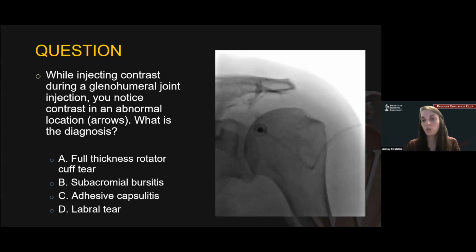Yep. So when we are having our patient in their position with their arm by their side and supinated, then I'll typically have my II just a straight AP to the patient. So when I'm advancing my needle, it becomes really easy because you don't have to induce any angles. You can just essentially advance your needle perpendicular to the table, which makes things straightforward. So a straight AP to the patient once they're set up.